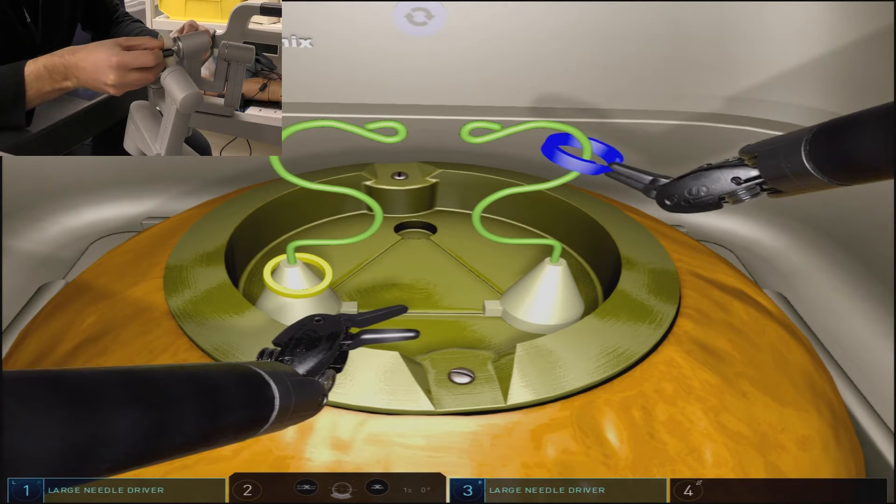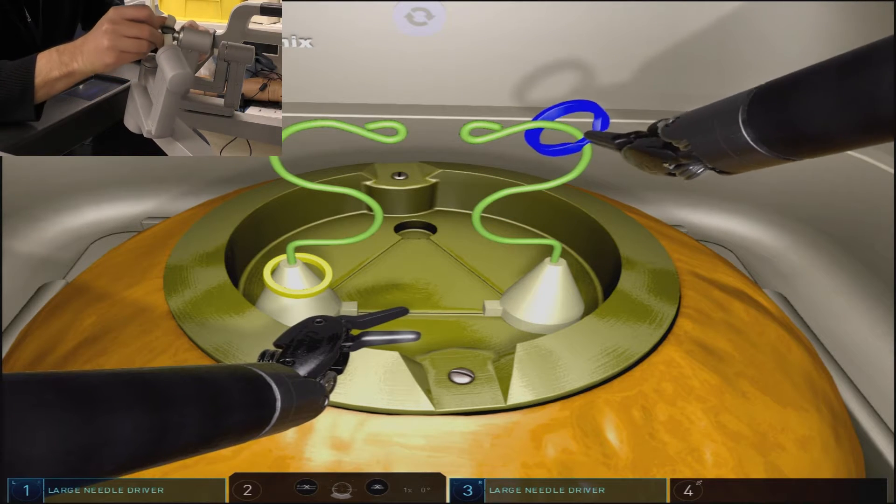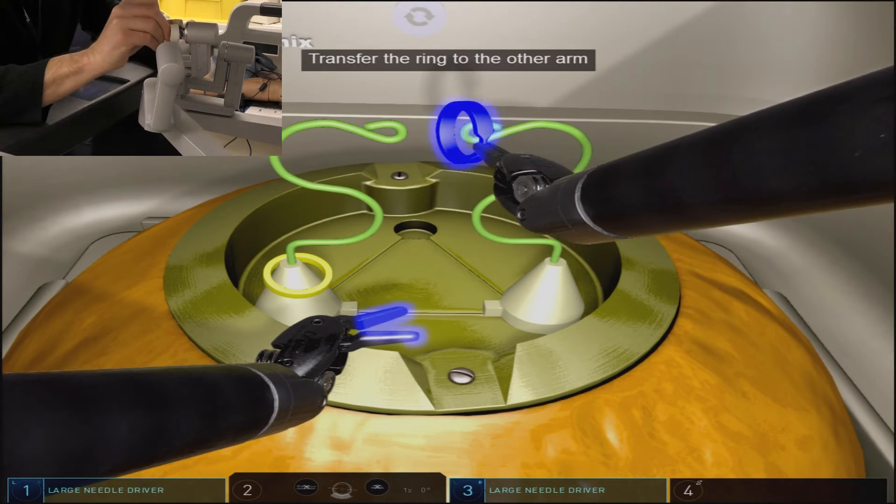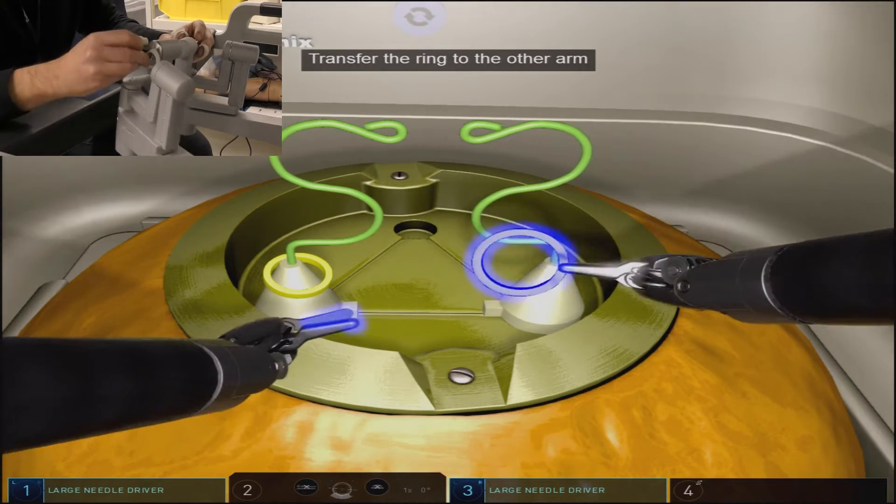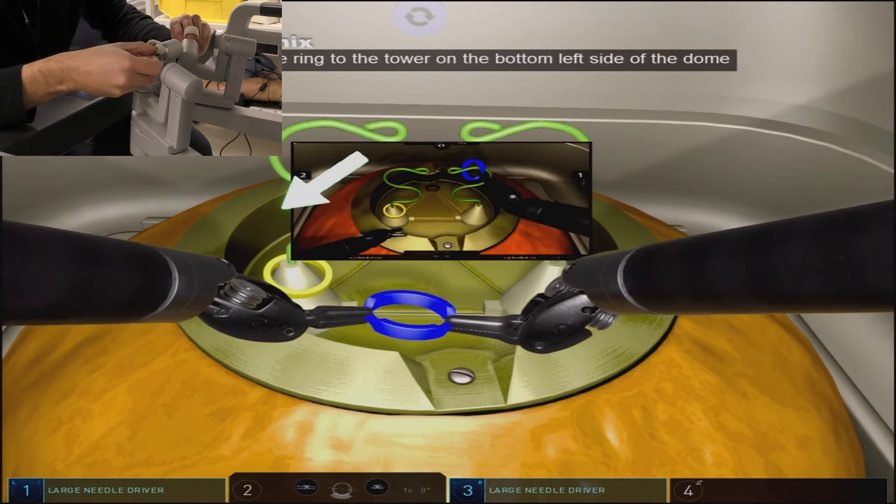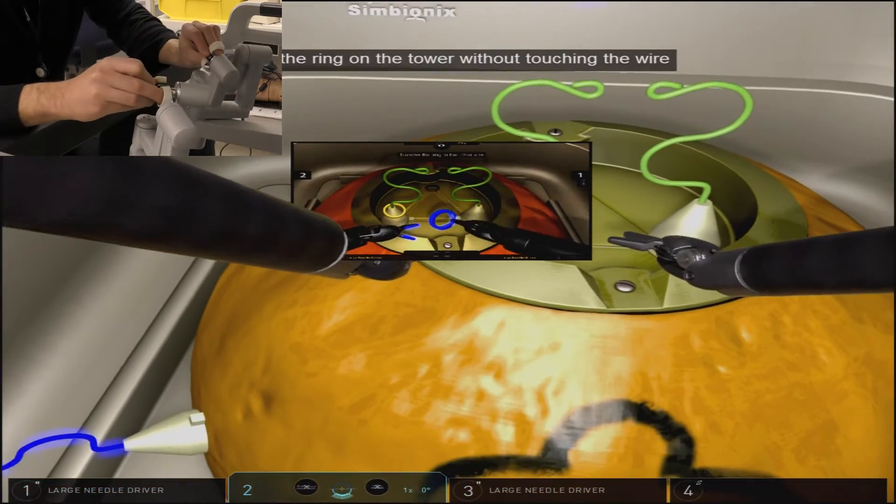By grabbing the ring in the supinated position, this allows you to use the range of motion and wrist articulation to navigate the wire structure.